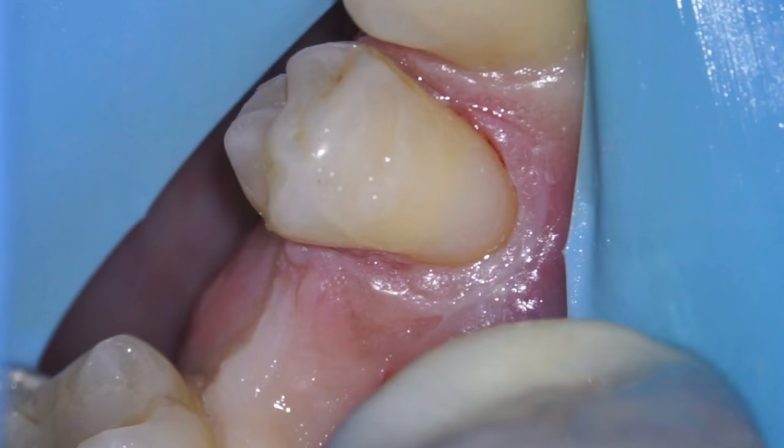Now you know that we can fix gum line cavities with filling material — it's actually quite simple to do. I have seen a lot of these restorations done poorly in the past, and I think the number one issue is that dentists don't always spend the time to isolate the area from moisture, because if any moisture gets underneath the filling then we're in real trouble. That's why I spend the time to get that step band around the tooth, and then we're in good shape from there.